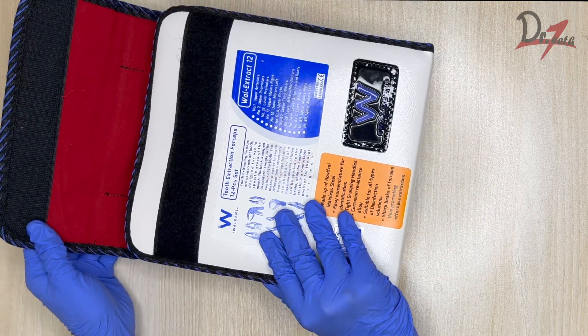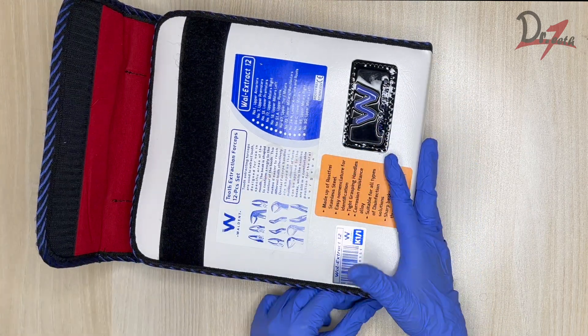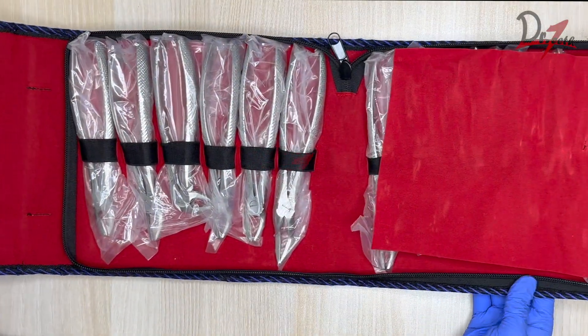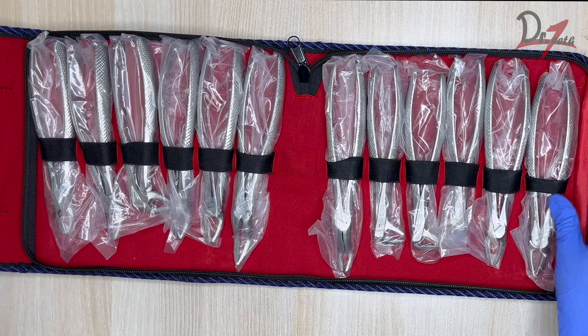Here is the box. Let's open it — and yes, this is the extraction forcep kit.